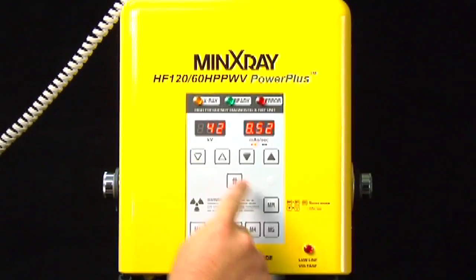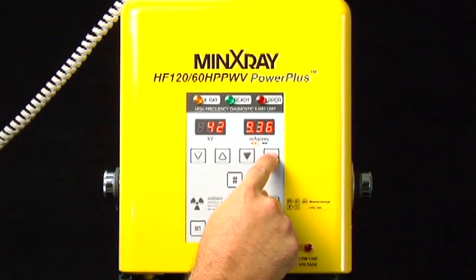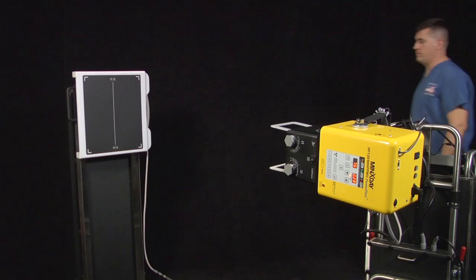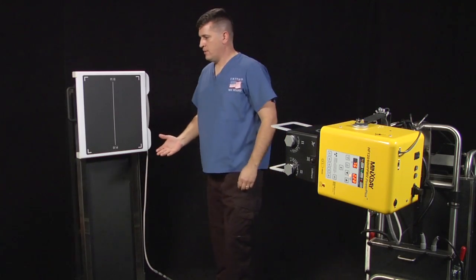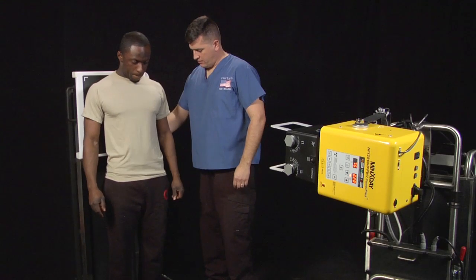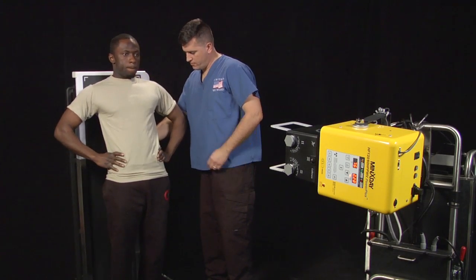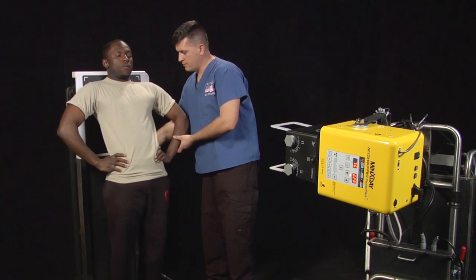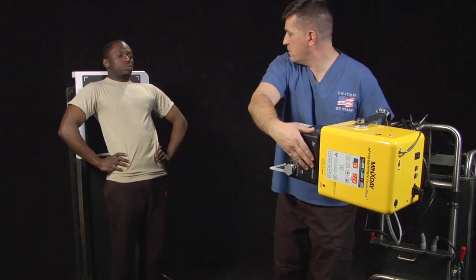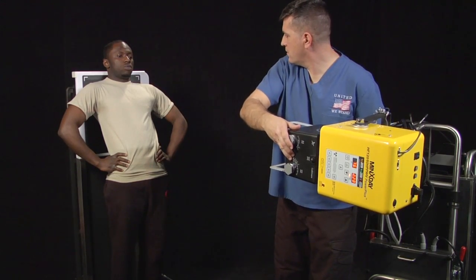Set KVP and MAS on the front of the X-Ray tube head according to the techniques on the technique chart provided. Position the patient one foot in front of the upright cassette holder with back towards the holder. With hands on their hips, rotate elbows and shoulders forward. Have the patient lean back until the upper shoulders make contact with the cassette holder.